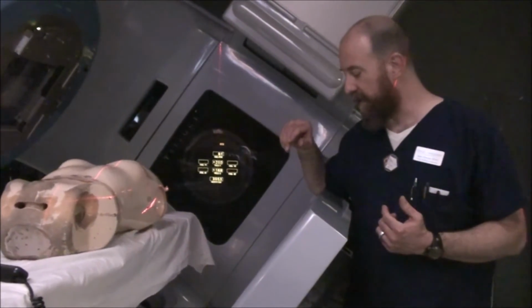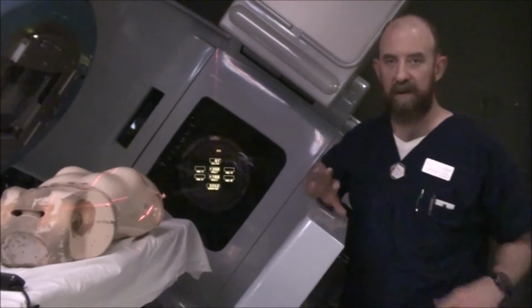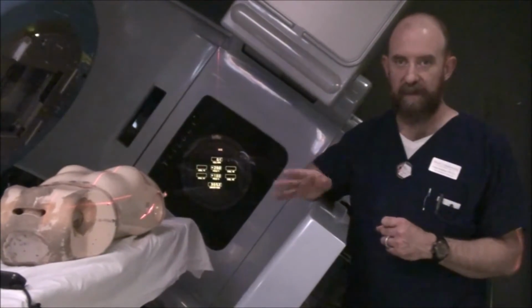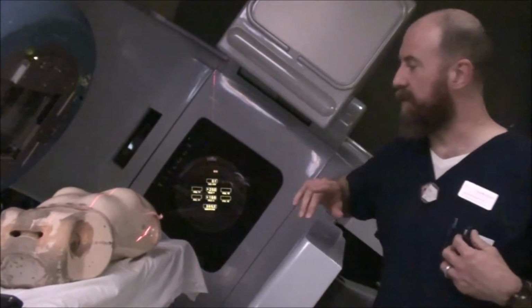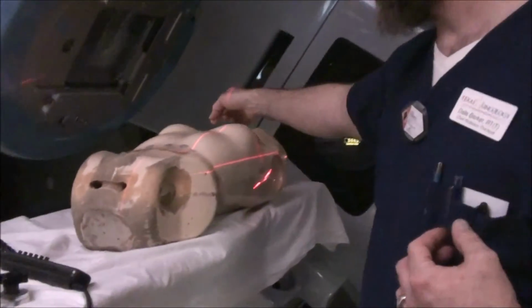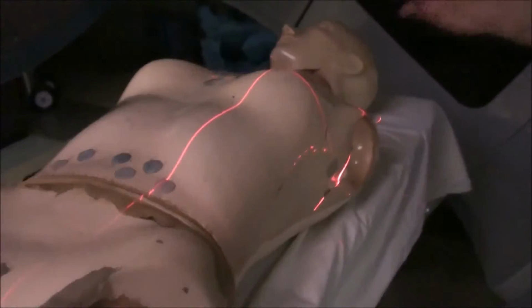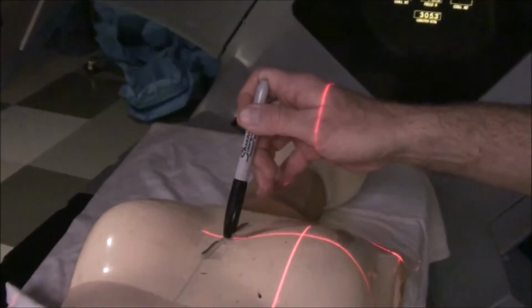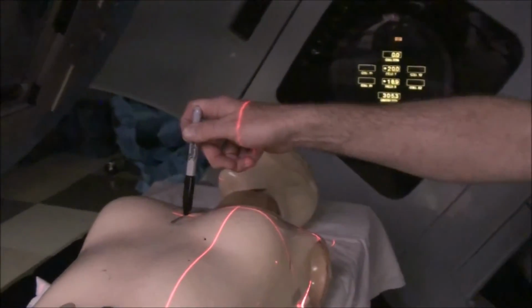So, let's say we've done that. If the doctor likes everything and everything is cool, you're going to notate everything: collimator field size, gantry, table. Come in the room, and you're going to actually mark your patient. I'm not going to do it right now because I can't reach, but you're going to actually lift the wire a little bit and put a little mark on the patient, put the wire back down. Read your SSD to that point.